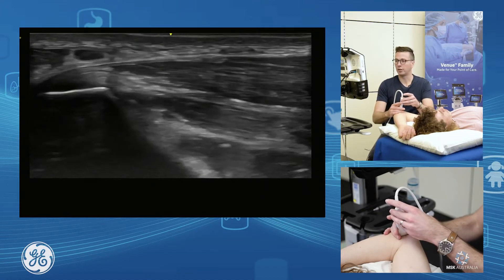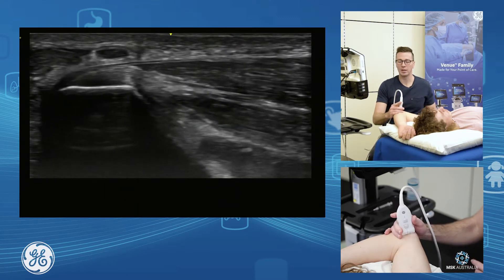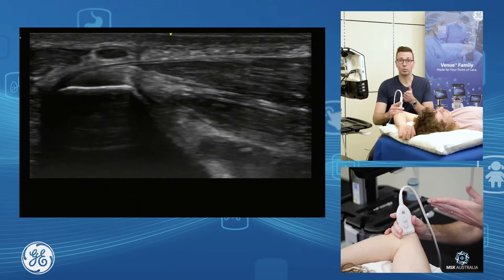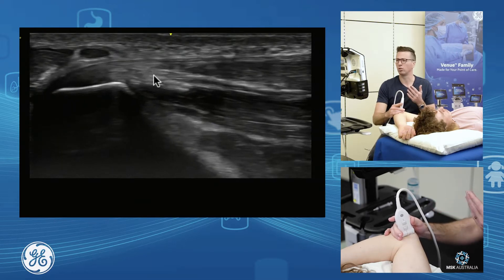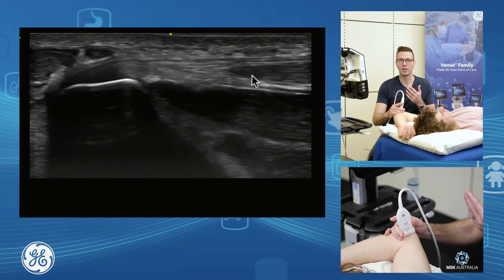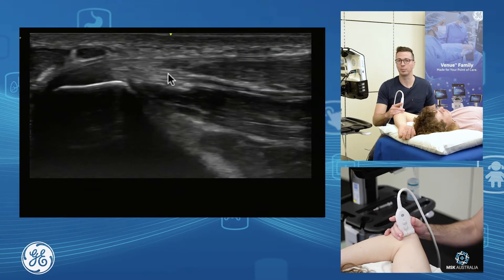Once I sit on the top, I grab my bony facet anatomy and I'm going to angle my probe towards the patient's thumb. As I angle towards the patient's thumb, I get truly more on that common flexor tendon and I can see the musculotendinous junction quite nicely — so angling towards the patient's thumb.